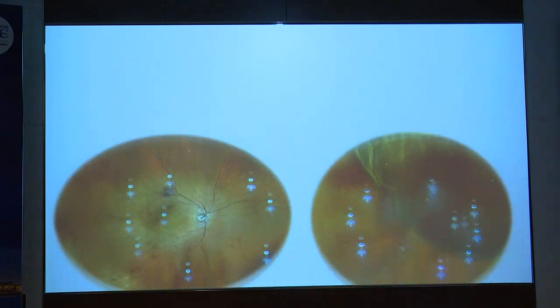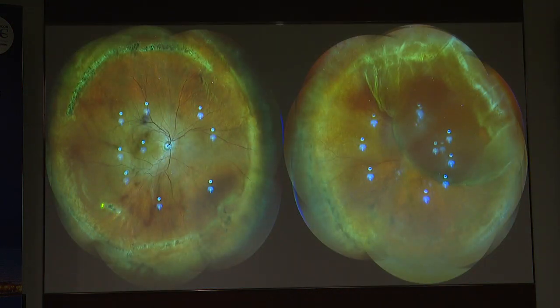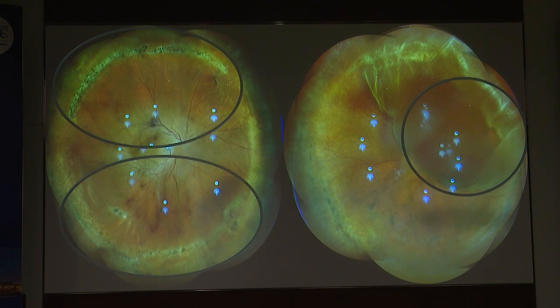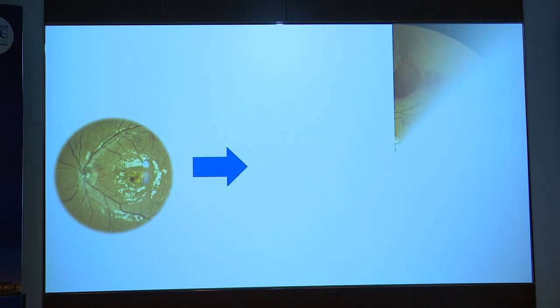Case number 15. Now this is a case of a subclinical RD. You could show the patient what it means to have a lattice degeneration. We could do the laser first for the better eye and then treat the other eye. This is how it helps you in convincing the patient. Another case, I will just run through this. These are routine cases now, how it helps.